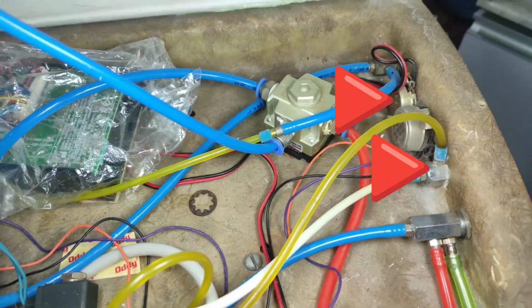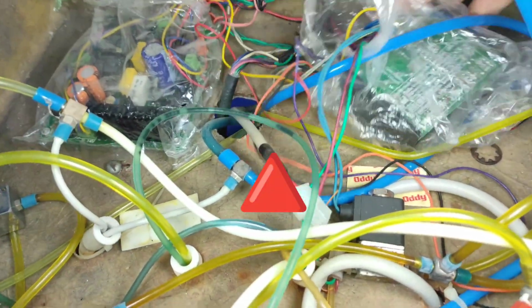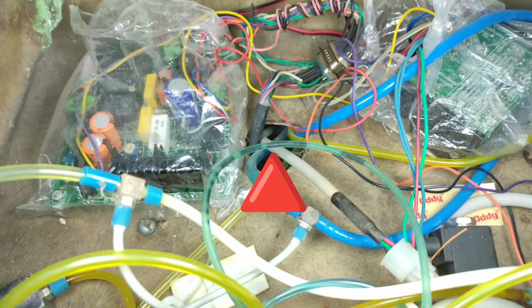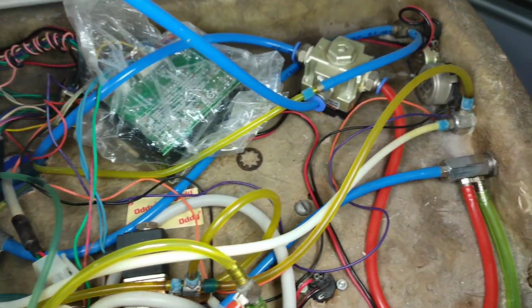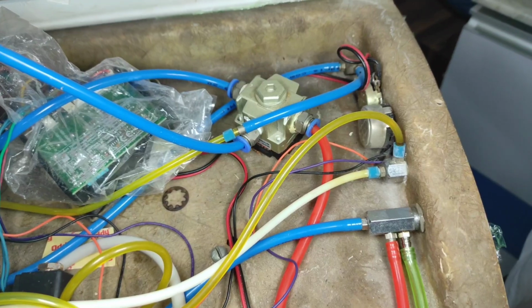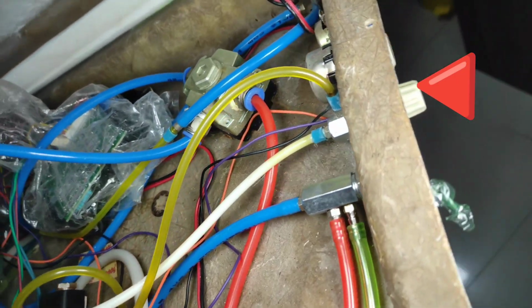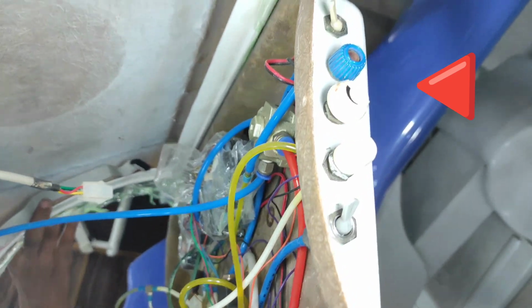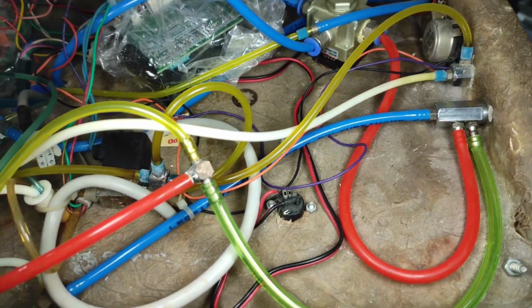Here, a central hole is where all the tubings and the current come from the base of my dental chair and enter over here, and then you can see the water and the air pipings are attached over here and they get distributed. These are the side water controllers, scaler speed controllers, and air rotor management connections. From there, water and air is transferred everywhere.